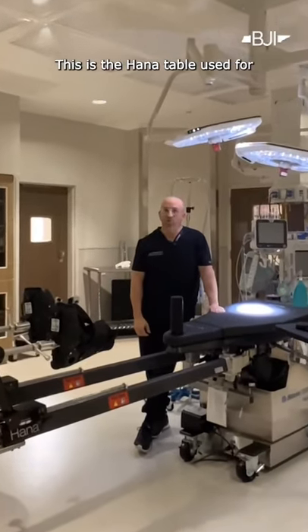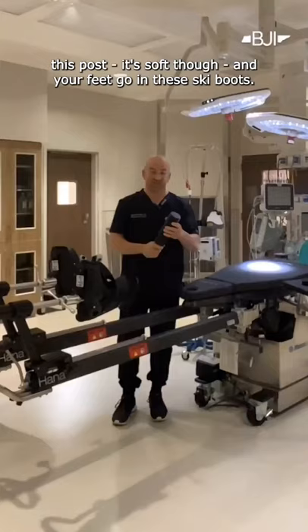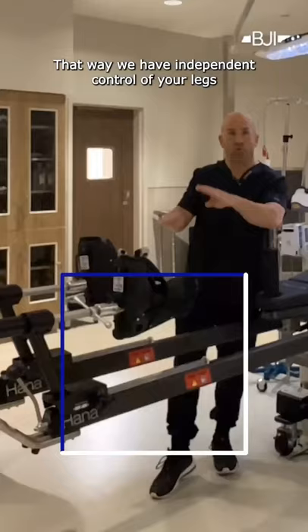This is the HANA table used for anterior total hip replacement. Your head goes here, you lay on your back, you straddle this post — it's soft though — and your feet go in these ski boots. That way we have independent control of your legs during the procedure.